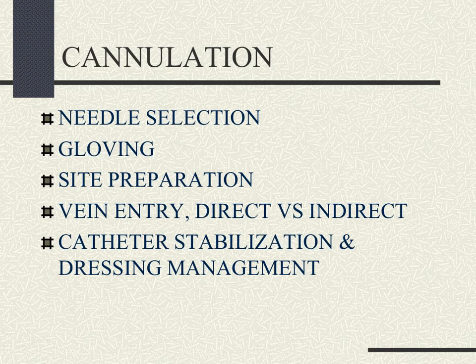Cannulation is when we actually start the IV. We need to be mindful of the needle selection. The appropriate size is the most important decision. We need to make sure, again, that we're mindful of infection control and are wearing gloves. We need to prepare the site per policy. There needs to be a vein entry, whether it's direct or indirect. And then we need to be mindful of catheter stabilization and dressing management.